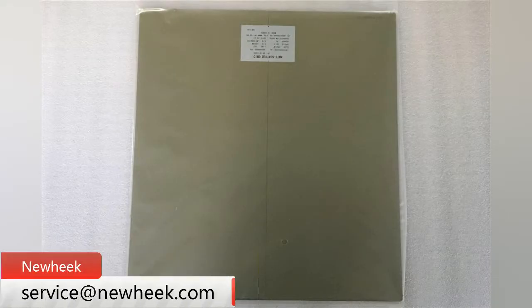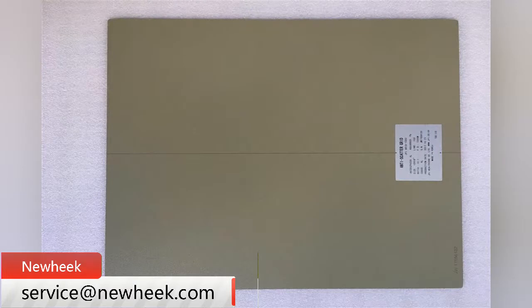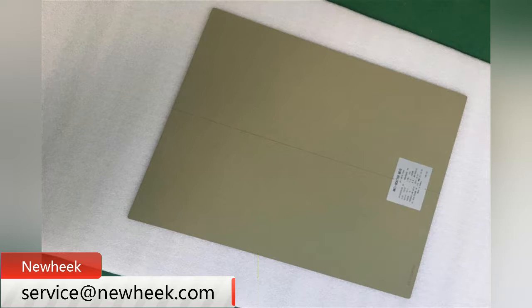Nuheek offers a full range of outgap x-ray grids to provide radiologists with the highest and most accurate quality. Nuheek x-ray grids contain the purest lead, which ensures excellent efficiency in removing scattered radiation.